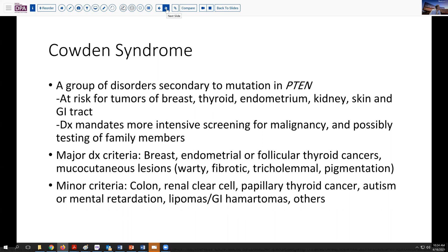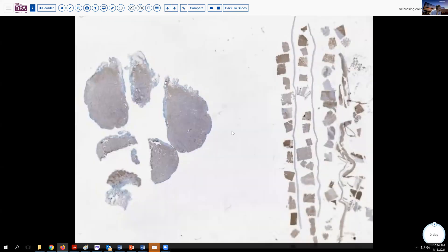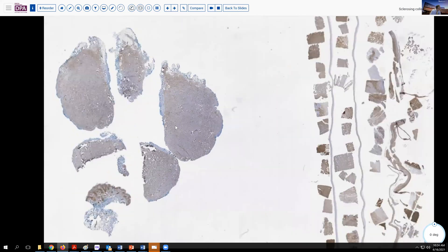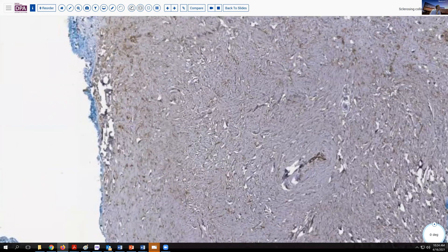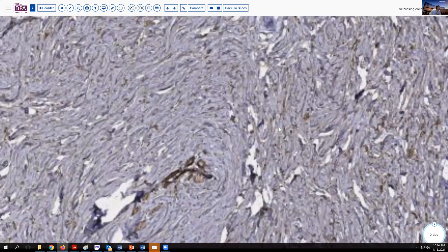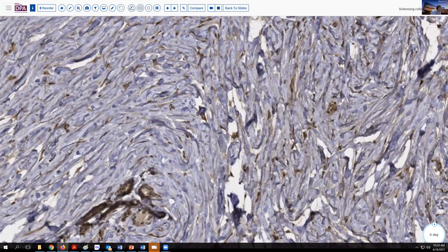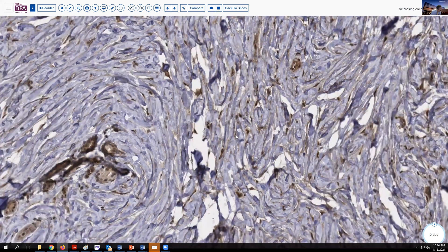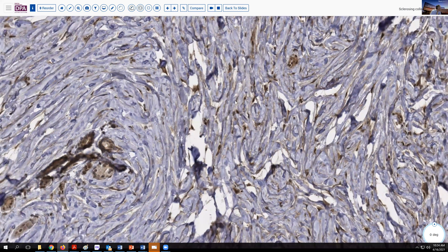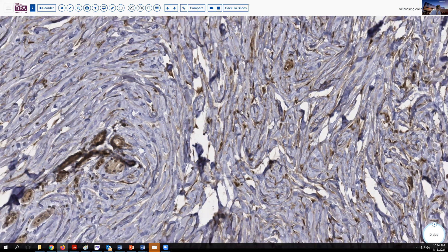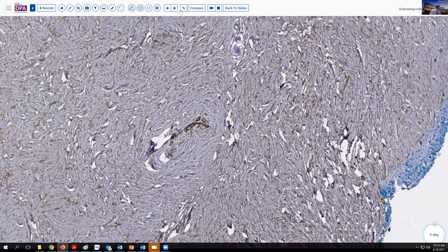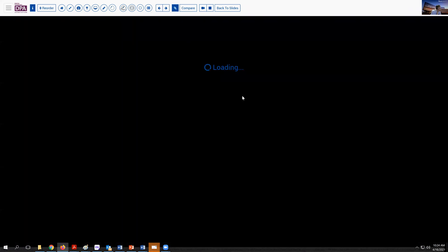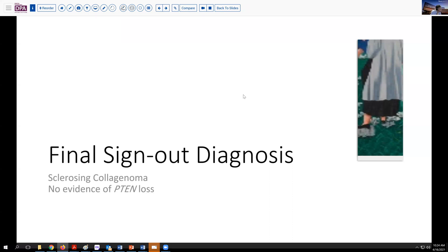We attempted to evaluate this by actually doing a PTEN stain on our tissue. In this situation, we would be looking for loss of PTEN reactivity. As you look here, we can see that there are many of these nuclei, if not most, that are nicely positive with PTEN, indicating that this is not a deficiency syndrome. Our final sign-out diagnosis is sclerotic collagenoma without evidence of PTEN loss, and therefore not a candidate requiring more extensive screening and follow-up.